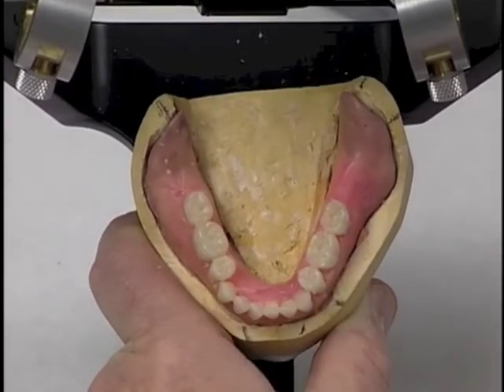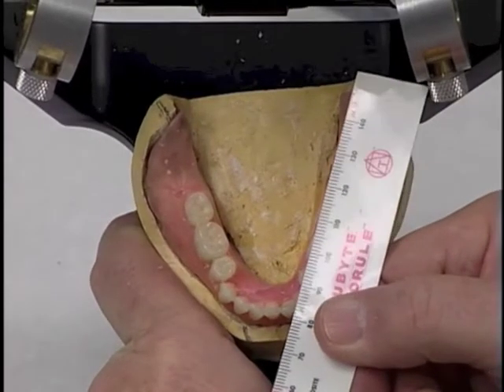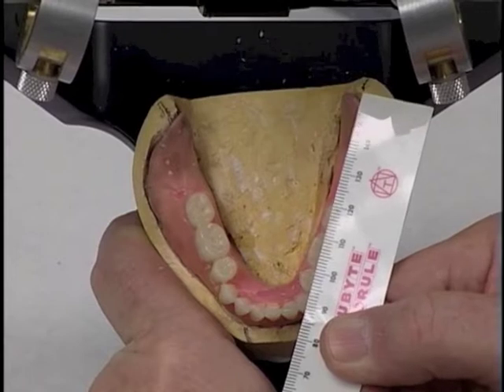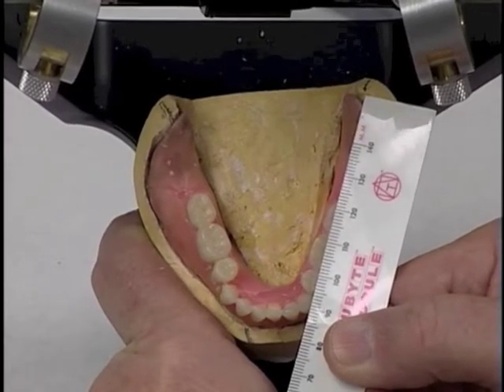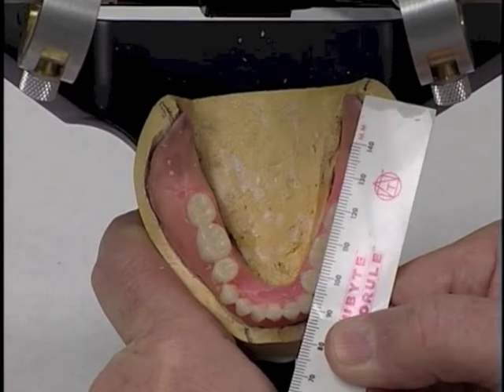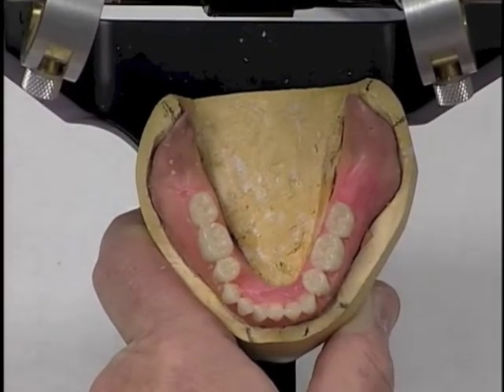The same is true, a little harder to do over here though, of the other side, the right side, patient's left side, I'm sorry. And if we line those marks up, we see those central grooves are over the crest of the ridge, maybe just slightly buccal to the crest of the ridge back in this molar region, but that's okay.